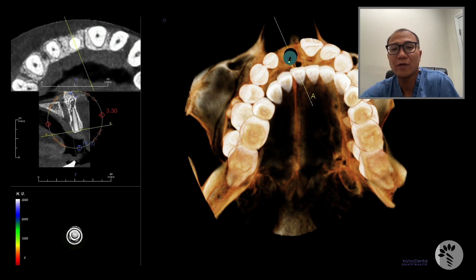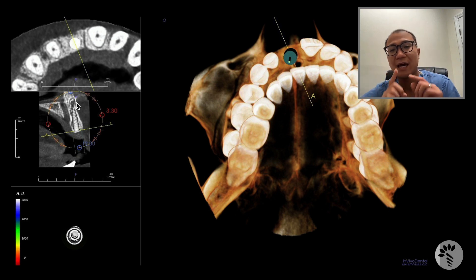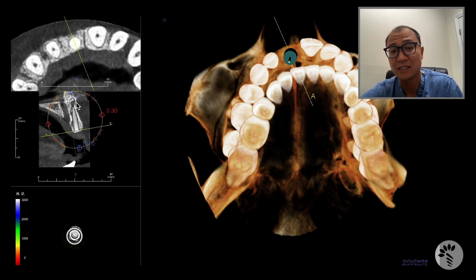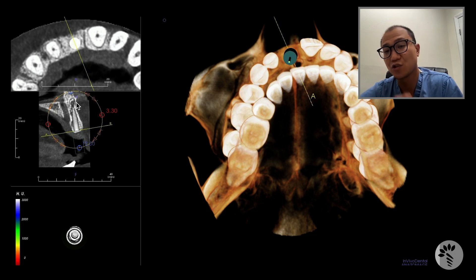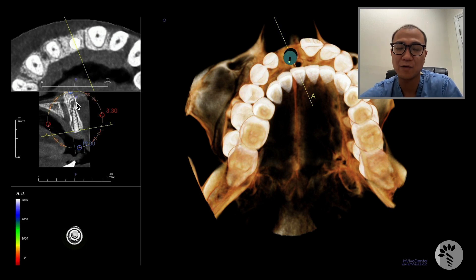When you look at the sagittal view closely, you can actually see there is a little bit of concavity in this area. I want to make sure that when I'm placing the implant, I do not cause fenestration in this area with my drill. So how do I design an incision that minimizes gingival recession on the adjacent teeth, but also gives me enough access to visualize this apical area?